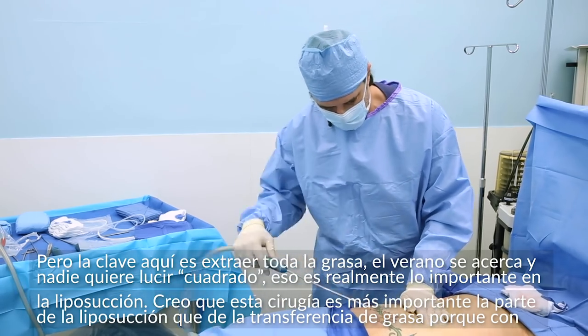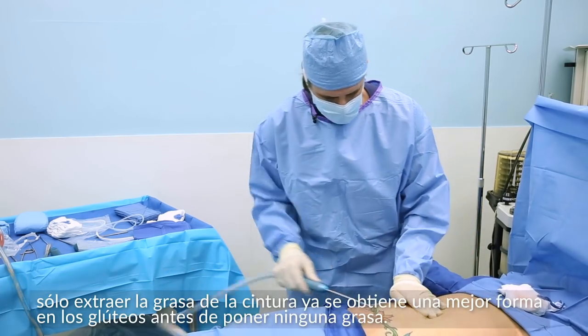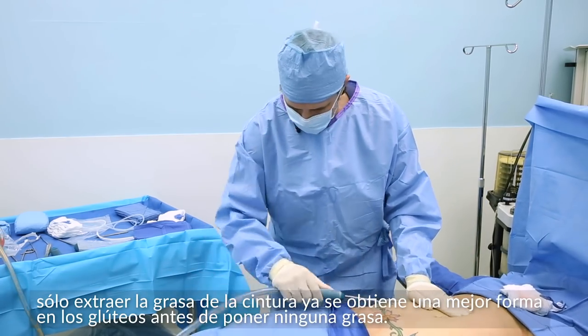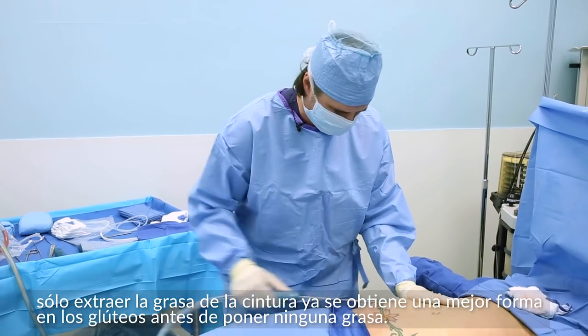In this operation, the liposuction is definitely more important than the fat transfer, because by carving out the waistline, you already get a better shape of the buttocks before you even put any of the fat transfer in.